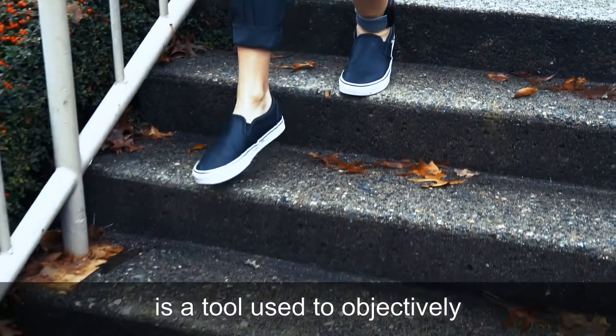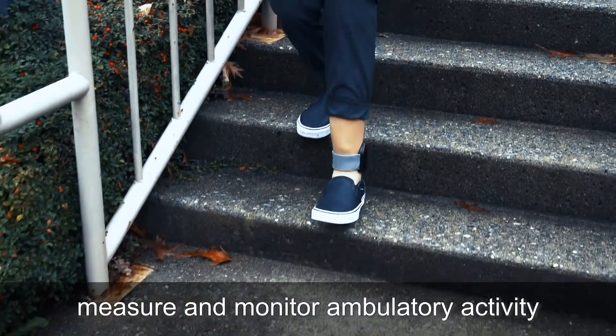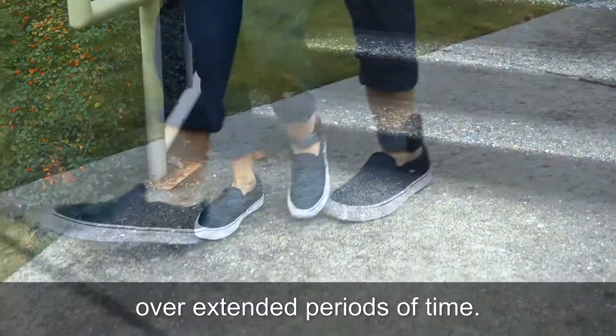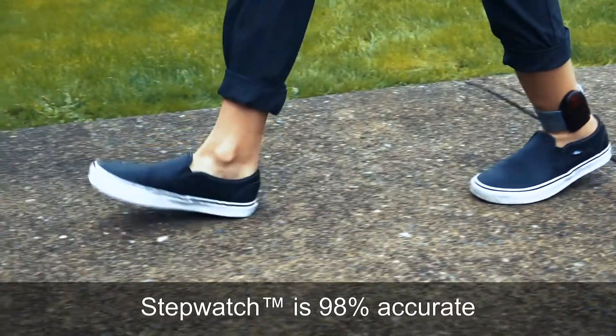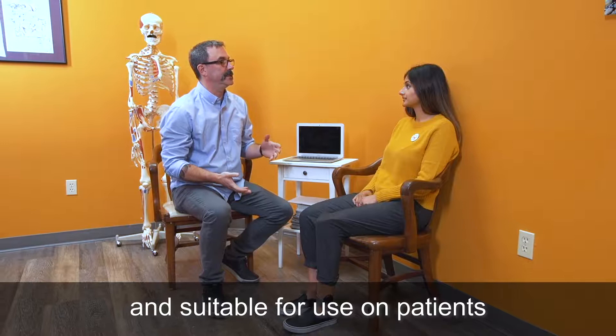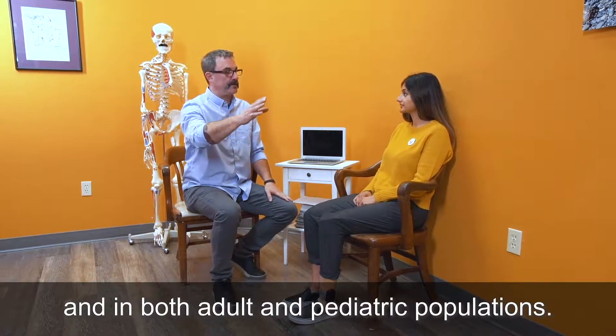The StepWatch Activity Monitor is a tool used to objectively measure and monitor ambulatory activity over extended periods of time. It is the gold standard for tracking daily ambulation activity. StepWatch is 98% accurate and suitable for use on patients with and without gait abnormalities and in both adult and pediatric populations.